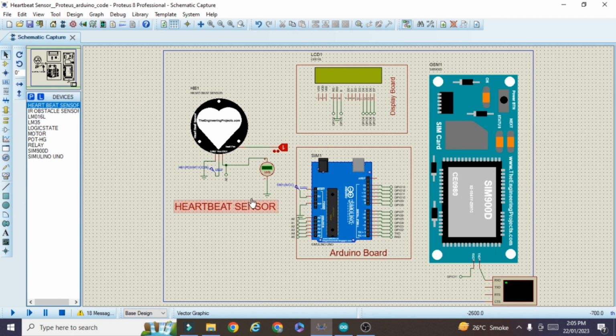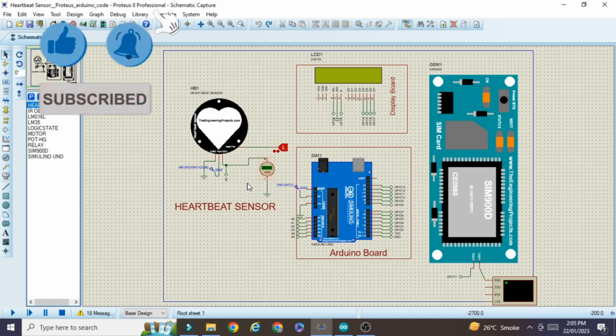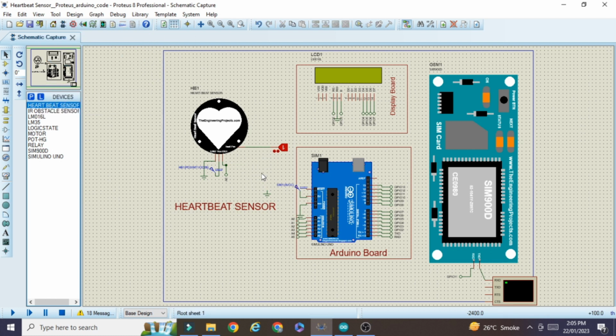Okay, during the hardware connection explanation, I forgot one point here. You can see this voltmeter is very important. If you do not connect this voltmeter, then your sensor will not work. So how to connect this voltmeter, I will tell you right now. I will first delete this so that I can explain to you.